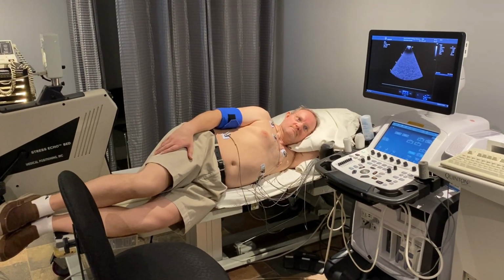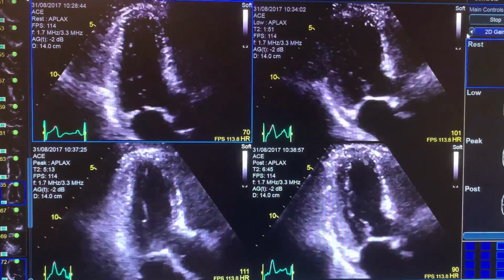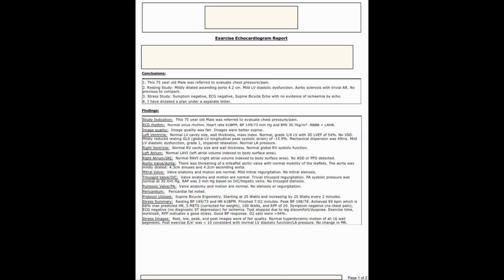I will ask if you got any symptoms during the test. And at the end of the test, I'll review the results with you personally. A report ultimately will be securely sent to your doctor or other health care provider. At the end of the test, I will review the images and I will review the results of the test with you. Once the data has been collected, I'll generate a report. This will be sent securely to your healthcare provider immediately after the test.